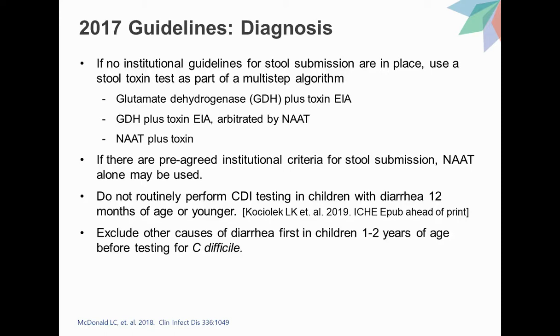And the second recommendation states, however, that if there are pre-agreed institutional criteria for stool submission, then a NAT test alone may be used. So what did the committee have in mind here? Well, what we had in mind in terms of these institutional criteria were whether or not there were stool rejection criteria by the laboratory for stools that were not liquid or soft, and also whether or not the institution had a way of assessing whether patients were receiving laxatives and other particular criteria that are described in the guidelines.